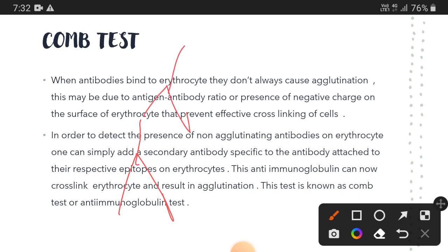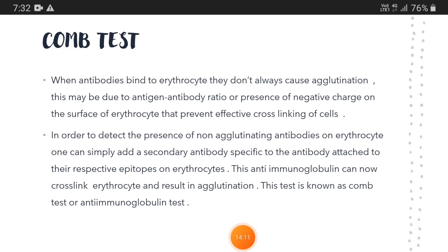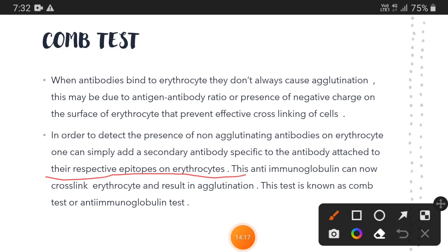So we are going to use that phenomenon, as those primary antibodies are already interacting with the respective epitopes of the erythrocyte.